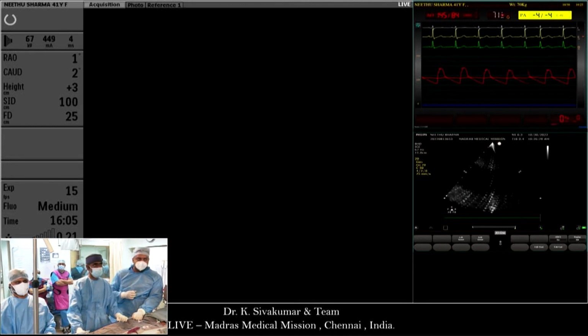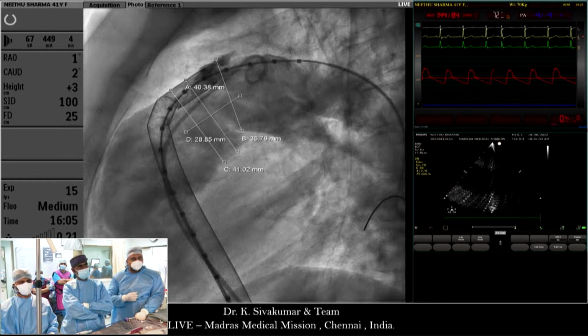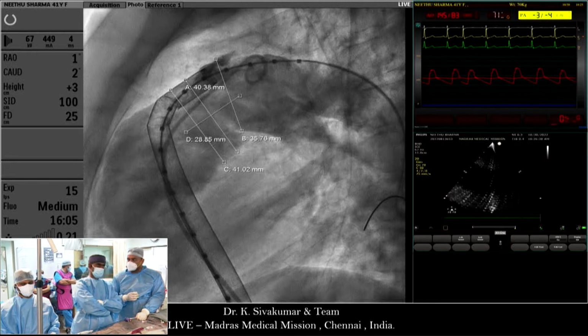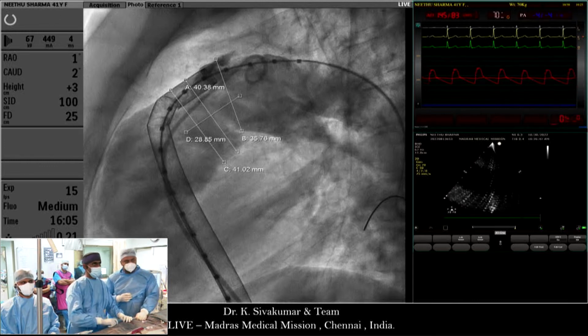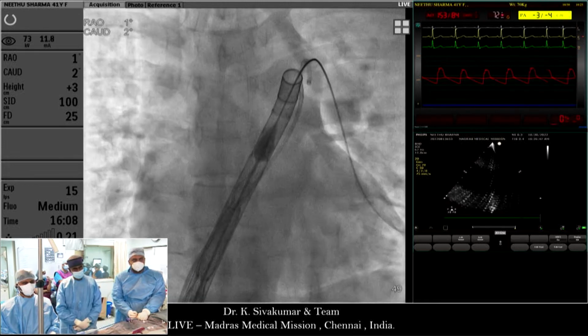For the sheath, I'm quite naive on this one, but to me it looks like it would very easily get kinks. So I may be quite careful when trying to pass that, but we'll see. Yeah, so now we are at that stage. Sorry, Shiva. Adam has a question or comment.